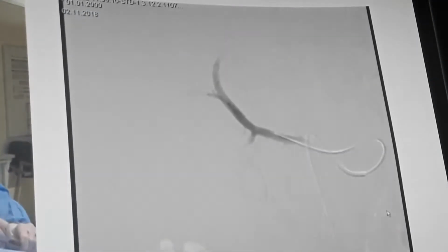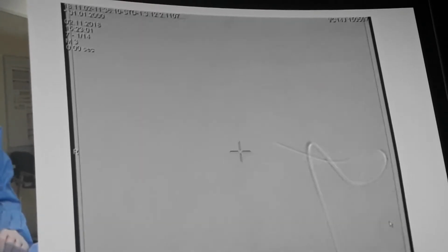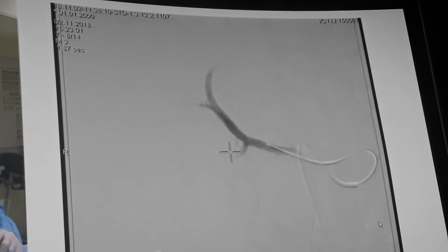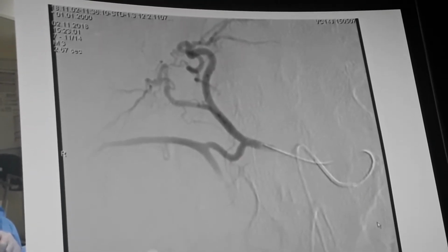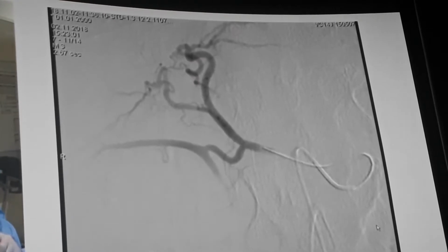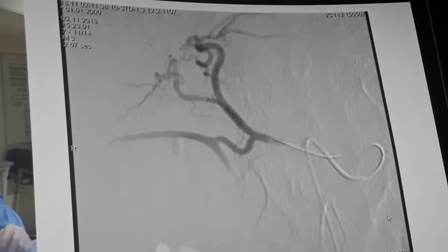Hold your breath. This is where I have to take a turn, as it were. I've just created another series of images I can use.